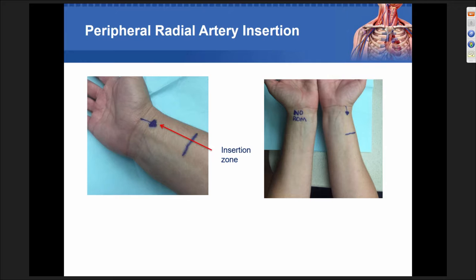By putting the catheter in that location, you're not allowing the patient to move or do any self-care, any of their own care in the hospital. And every time they move their hand, the catheter moves. So please, please, please make sure that if anything, you just look at this diagram and you move down 2 fingers, or where the watch band is, a great rule to think about.